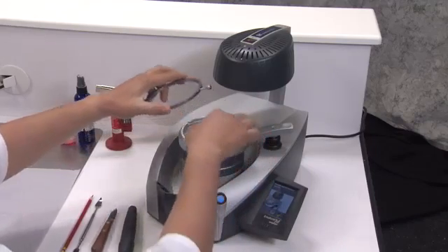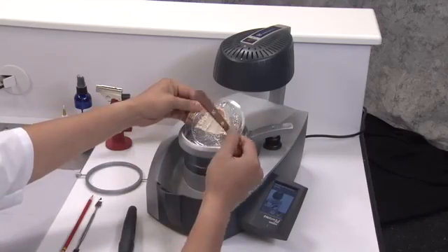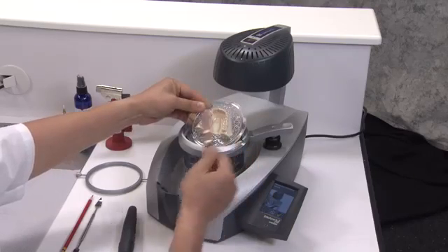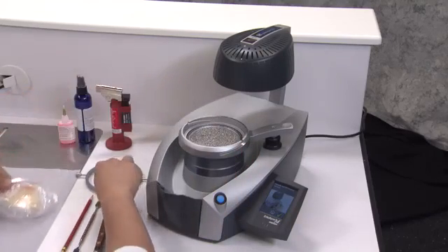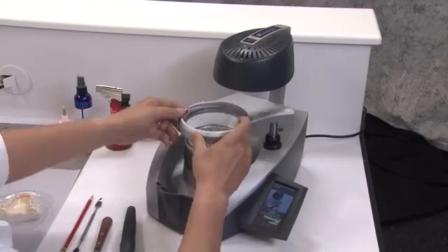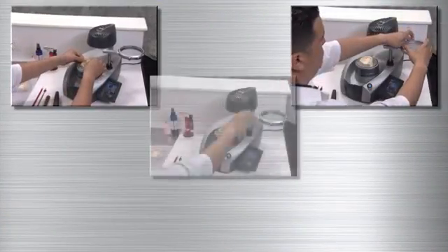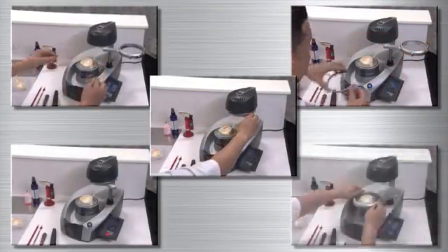Release the locking ring and remove the foil. Lightly tap on the foil to dislodge any granules that have stuck to the foil. Replace the locking ring to the foil holder. Lift and turn to the right. Use the same steps for thermoforming the opposing tray.